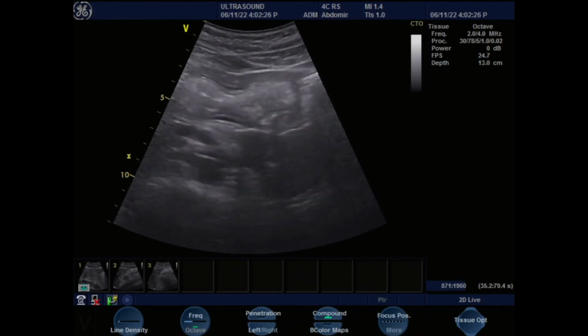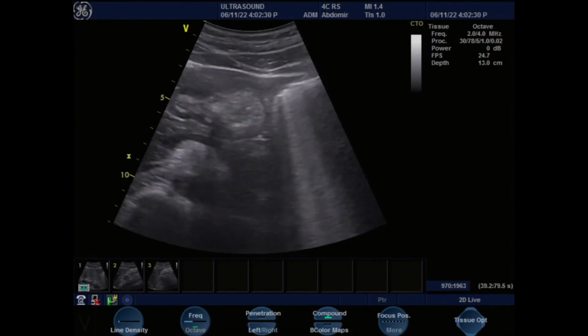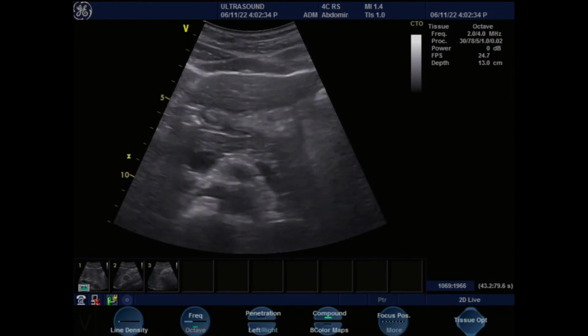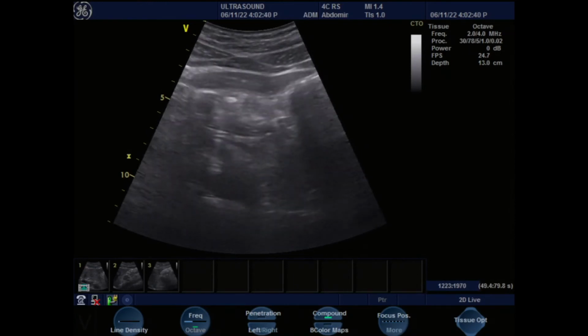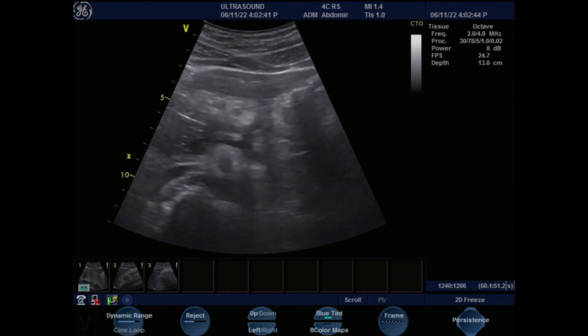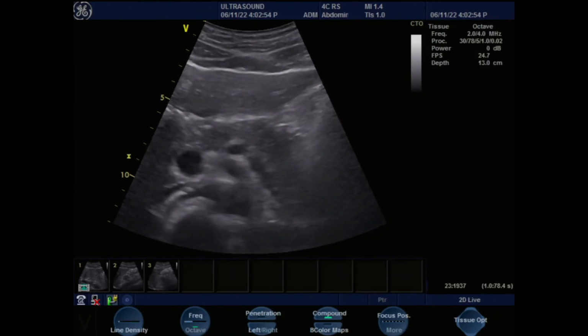Yes, if it comes in and out. So let's bring it up. There we go. Let me just squeeze it. See? Just reach over. So here's the head, body, and the tail coming in. So when I unfreeze, you'll see it move up and down. There it is, beautiful.